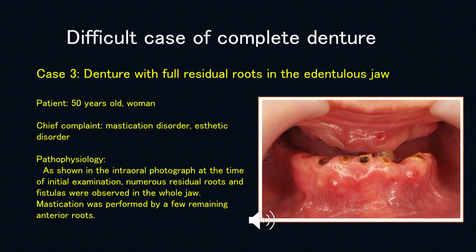Pathophysiology: as shown in the intraoral photograph at the time of initial examination, numerous residual roots and fistulas were observed in the whole jaw. Mastication was performed by a few remaining anterior roots.